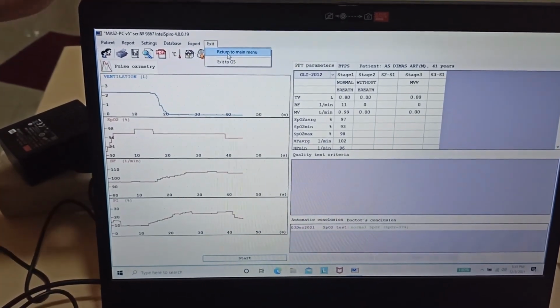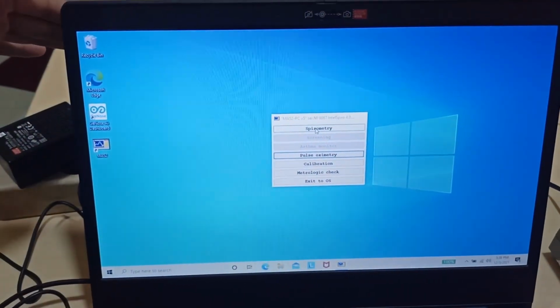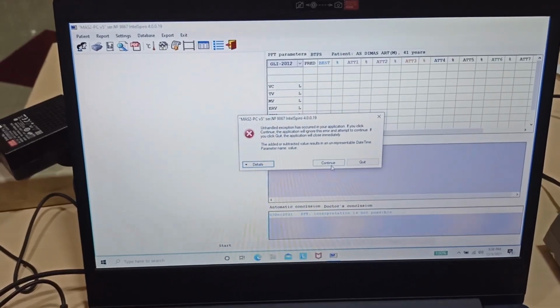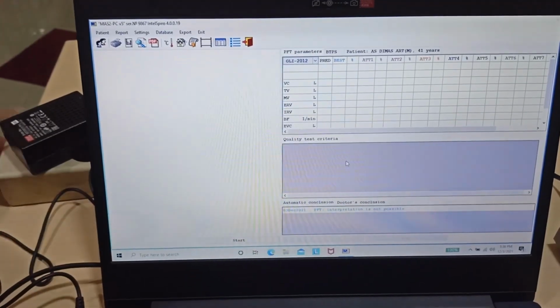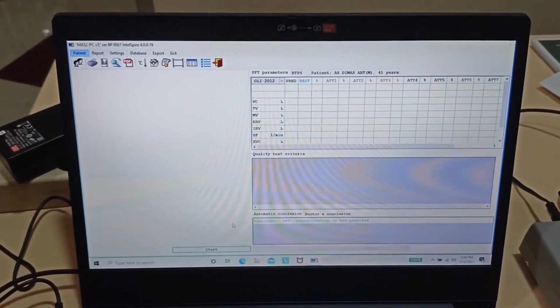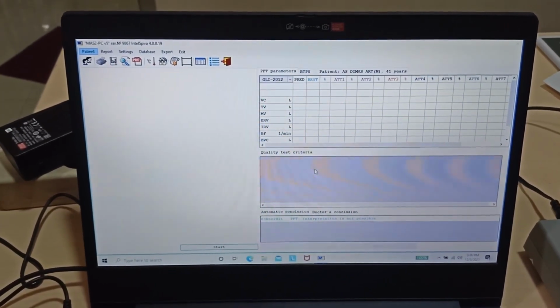Yes. Then go to Spirometer. Yes. Continue. Click Continue. So when patient A is also examined for spirometry, click Start directly. Click Continue. Click Spirometer.